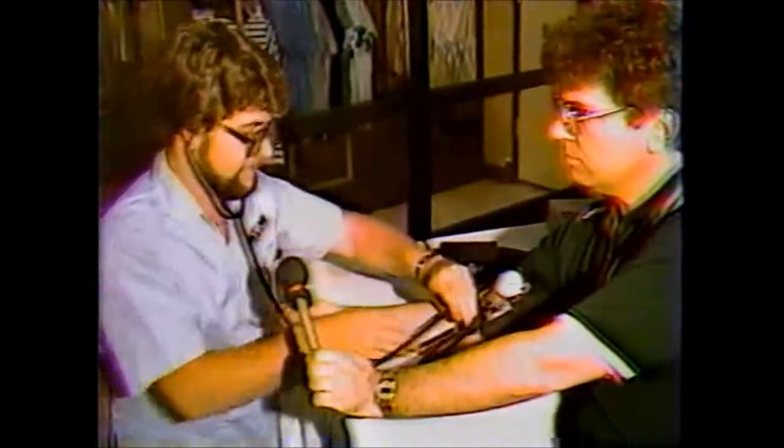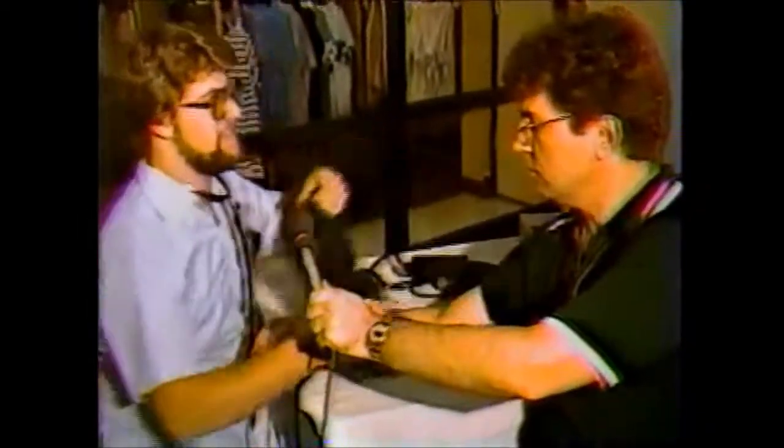Measuring here is the pressure of your blood as it flows through the artery in your arm. Okay. Now I'm going to guess and say it's going to be high because we're in front of the camera lights here. You're always more nervous on television than in real life, or so they tell me, so we'll see how we came out here. You're right, it's high. Okay. It's a little high. You might want to check it out, actually.